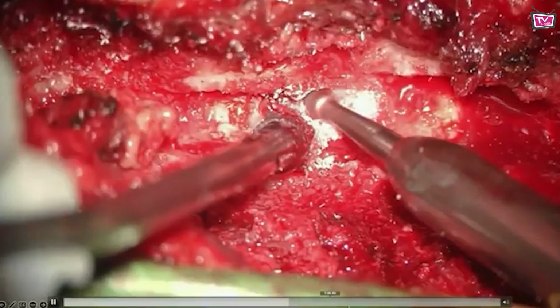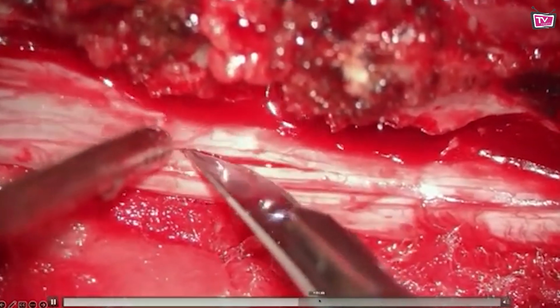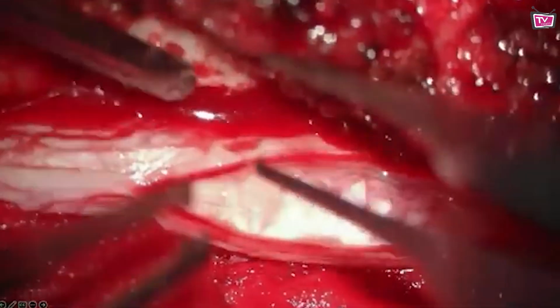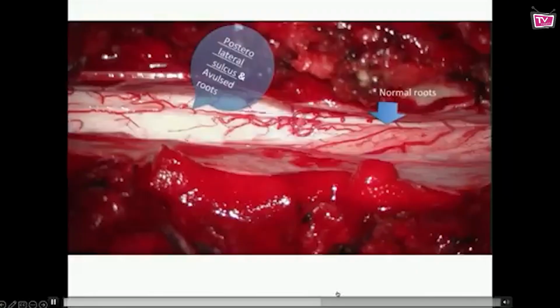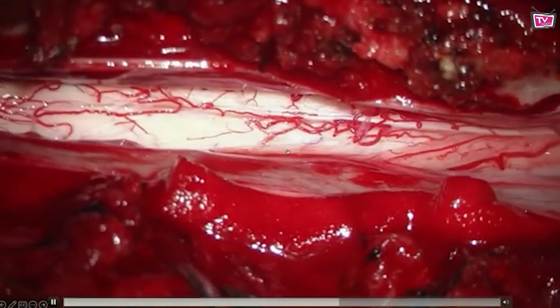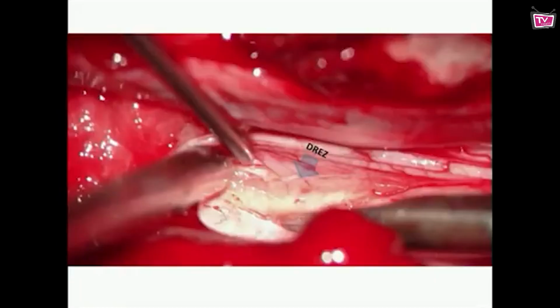So this is the hemilaminectomy which is completed. Now you open the dura in the paramedian area. So now you can see there is no root seen here. There is a normal root up and one below. So this zone has no roots because they are completely avulsed roots, and they have undergone degeneration. That is the area where we have to go.